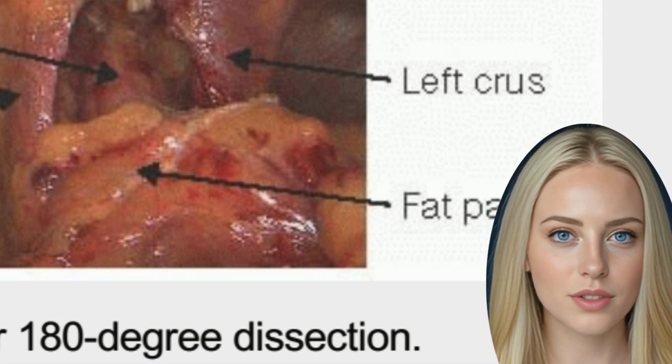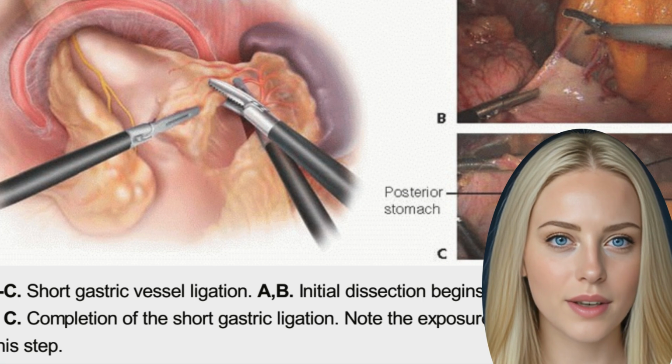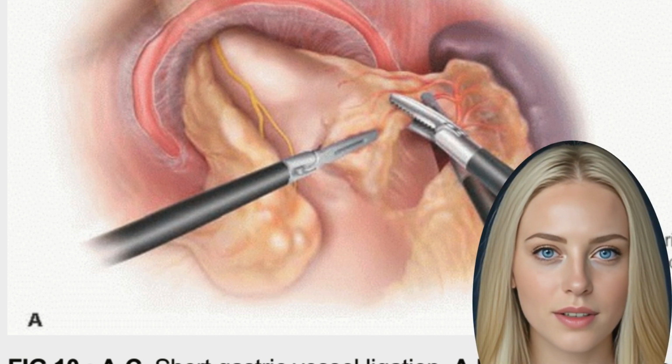4. An assistant's 5 mm left flank trocar is placed about a palm's width inferiorly and laterally from the 12 mm trocar. 5. Finally, a 5 mm port is placed and removed in the subxiphoid region for the Nathanson liver retractor. Similarly, a port can be placed at the right flank, symmetrically opposite from the assistant's port, for a linear liver retractor, as supplies may vary per operating theatre.